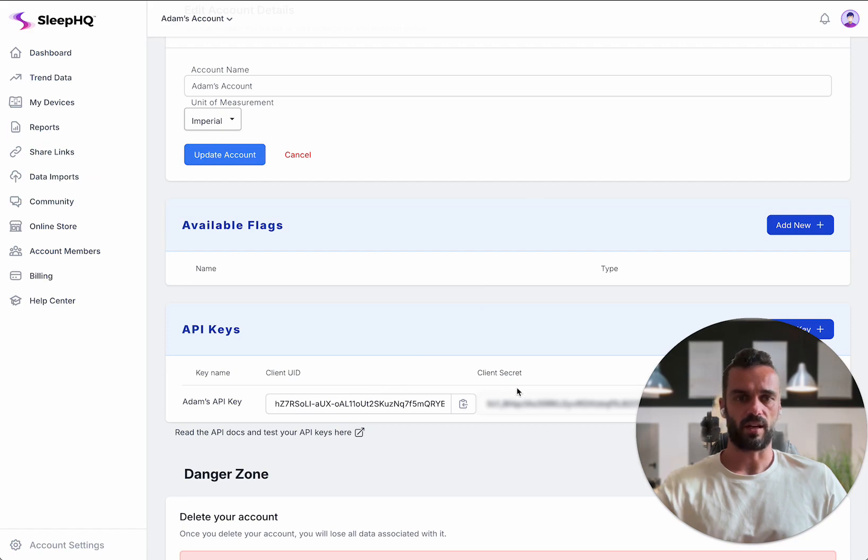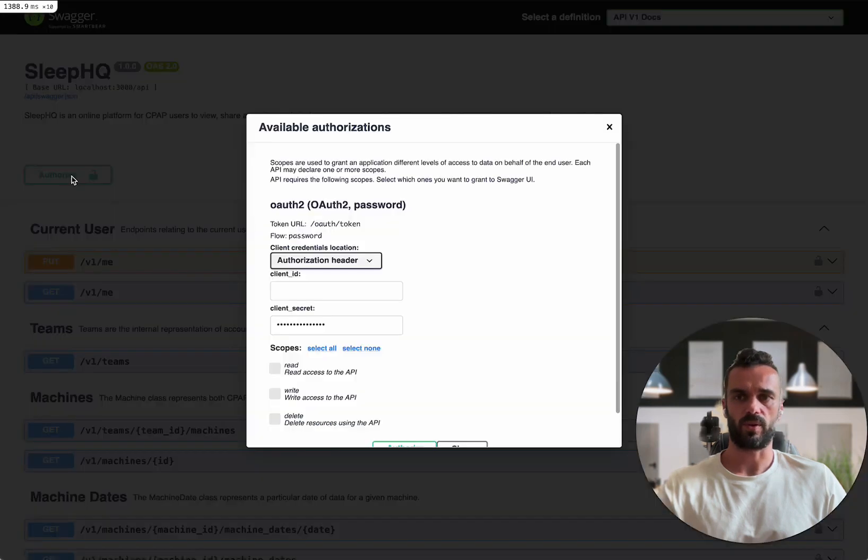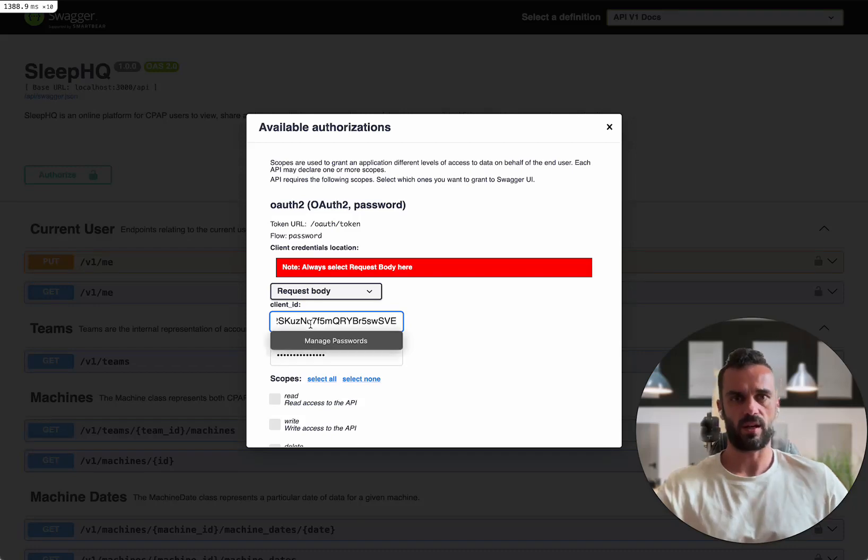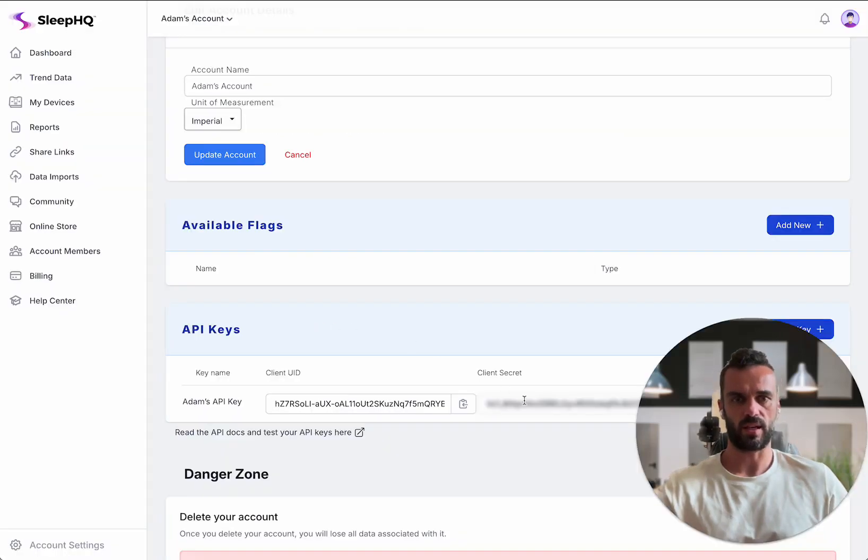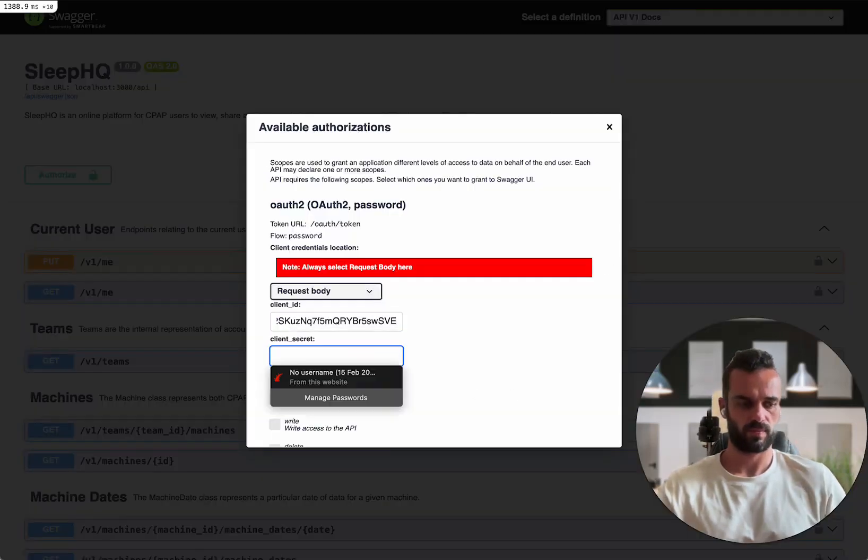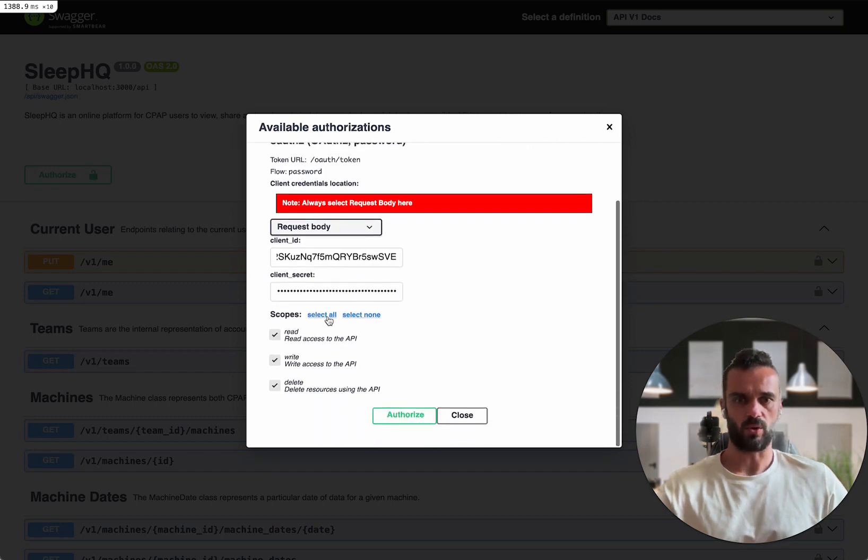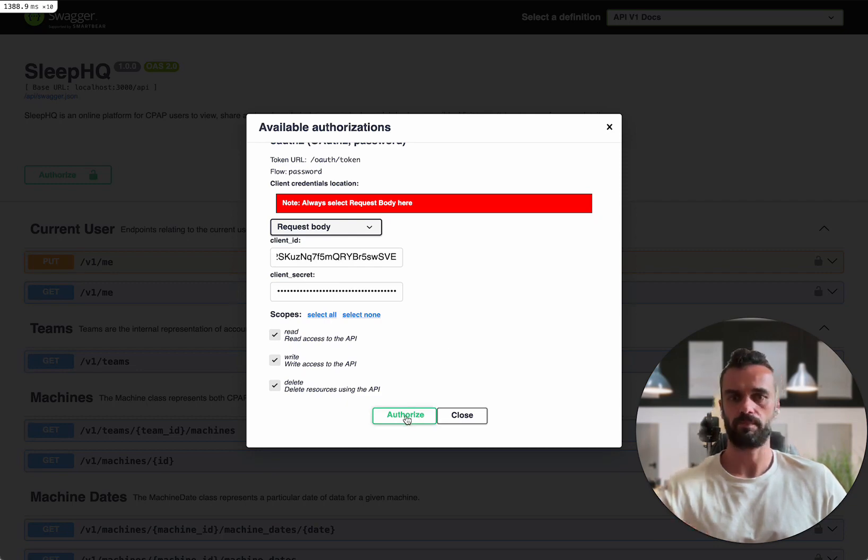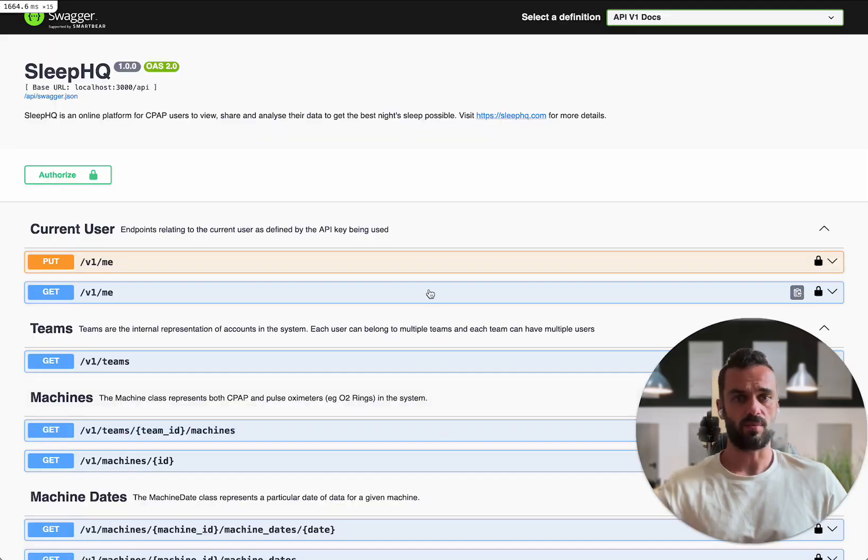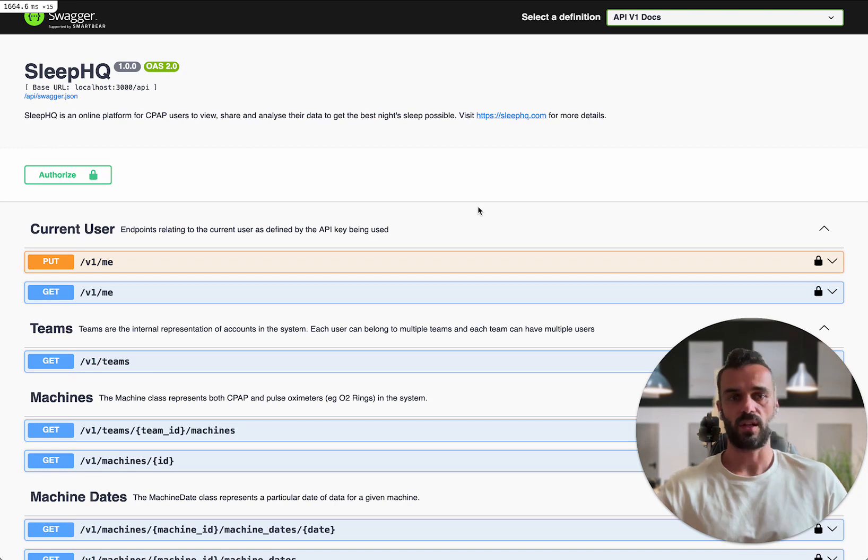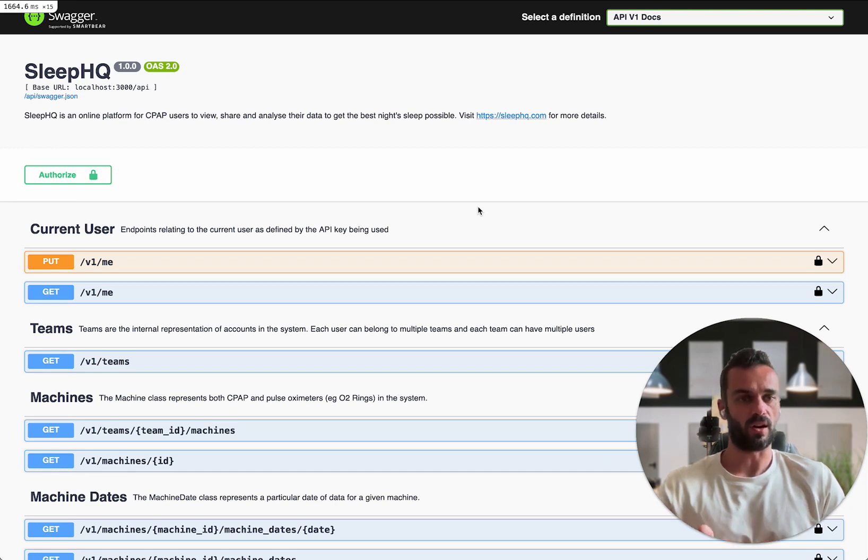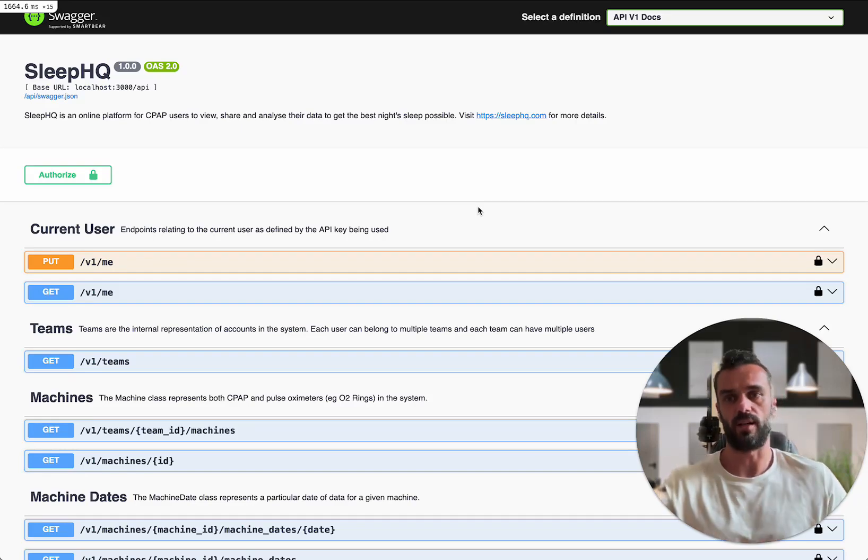I'm going to take the client ID and secret that we just generated over here and we've got this authorize button at the top. When I click authorize, I put this on request body and I'm going to stick in my client ID and the secret that we generated and say all scope. I can choose how I want to scope this key to read, write or delete access. I'm going to say for all of them and authorize. What that's now done behind the scenes is it's taken that client ID and client secret, hit the token endpoint and now we've got back a secure token that we can use to authenticate our API requests. That's the same process that you would do in your application to authenticate your requests as well.